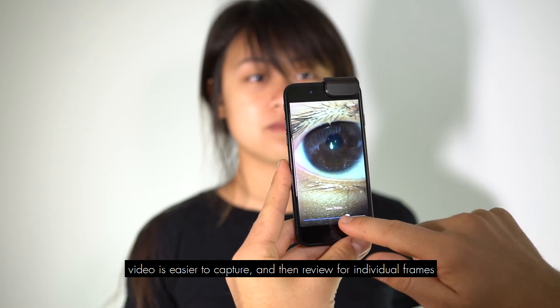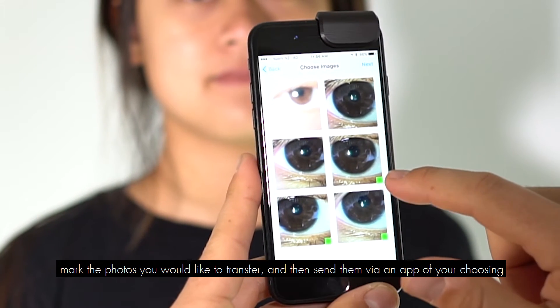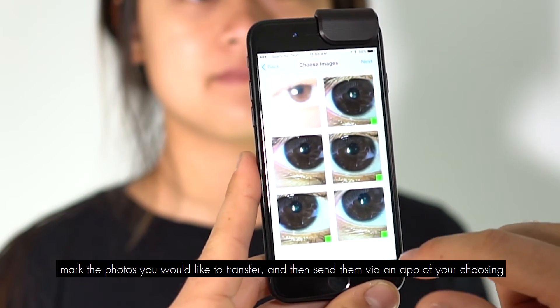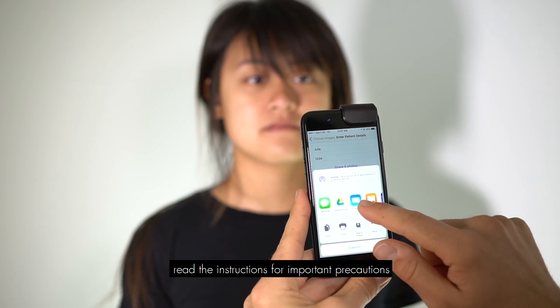Video is easier to capture and then review for individual frames. Mark the photos you would like to transfer and then send them via an app of your choosing. Read the instructions for important precautions.